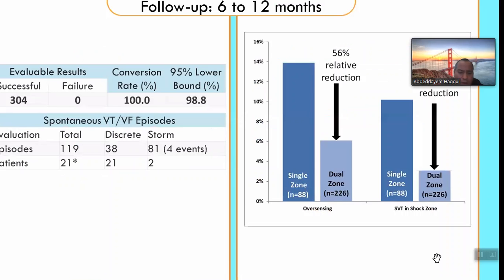The IDE study was a multi-center study which included 330 patients and which aimed to study the efficacy and safety of the SICD with a follow-up ranging from 6 to 12 months. The defibrillation rate during the DFT test was successful in 100% of patients.